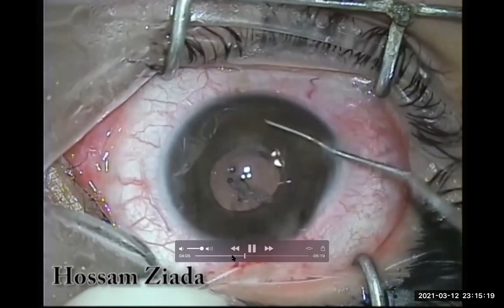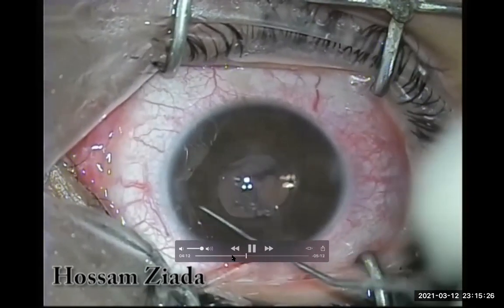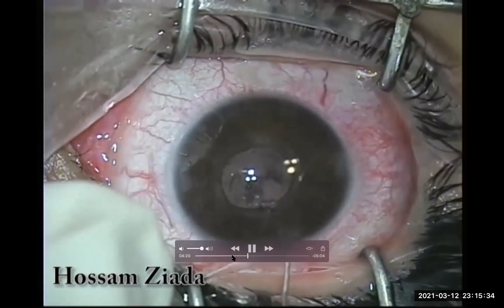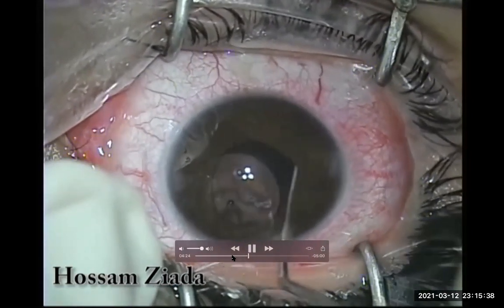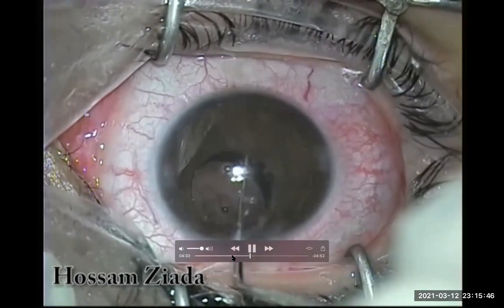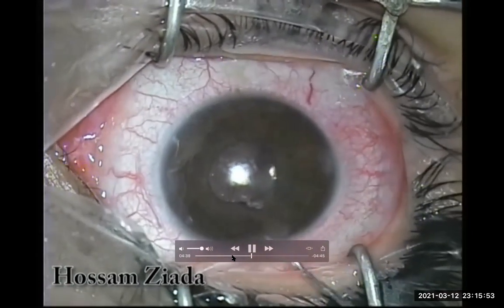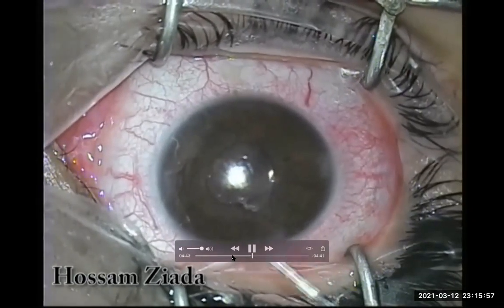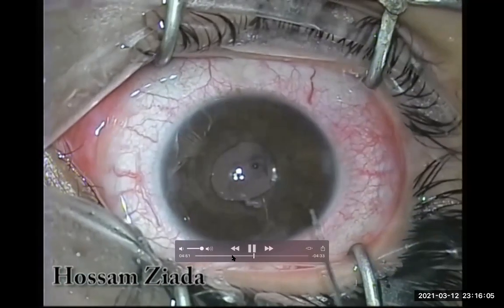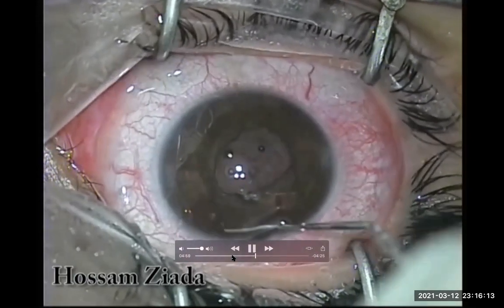I will insert the first haptic just below the iris to make the first fixating point, while keeping the optic above the iris all the time until both haptics are fixated. The optic remains in the anterior chamber in front of the pupil. The first haptic is done, so I will push it with an instrument to identify its shadow and its position, then push the optic up to know the site of the haptic and pass the needle just below it.